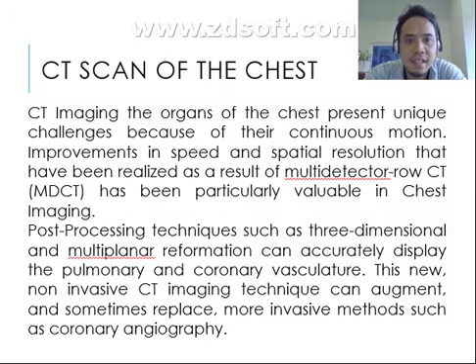So CT scan of the chest is the CT imaging of the organs of the chest, which presents unique challenges because of their continuous motion. Improvements in speed and spatial resolution that have been realized as a result of multi-detector CT, or MDCT, have been particularly valuable in chest imaging.